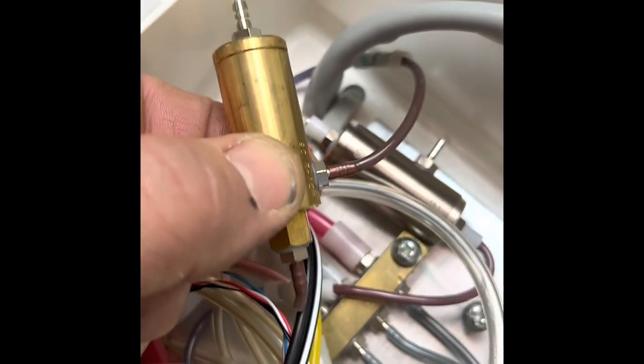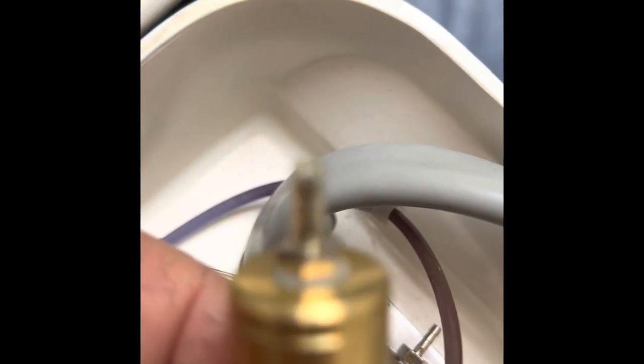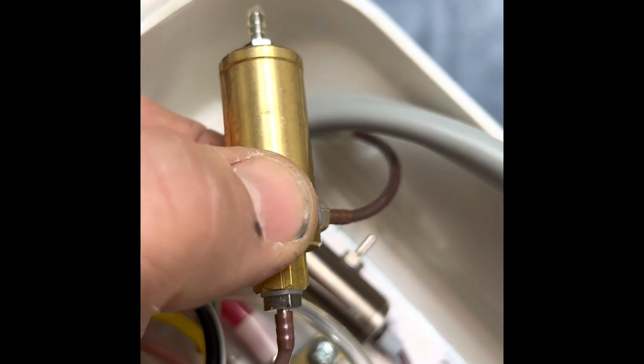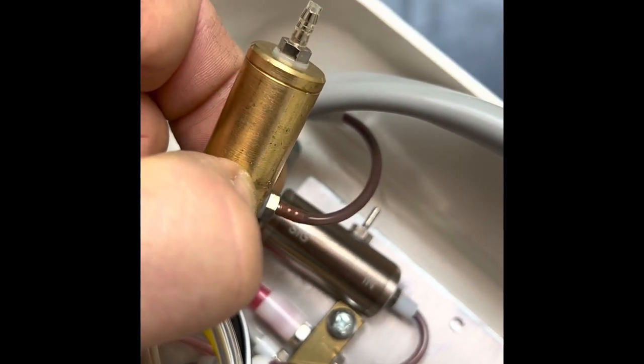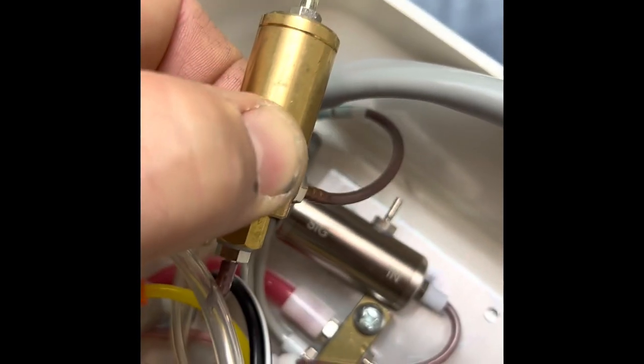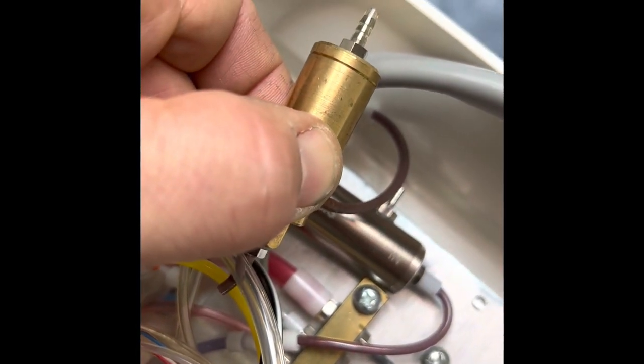Okay, I just found something really interesting. I just started replacing that and I'm hearing this little noise. Okay, so now I can actually hear it. So I think the diaphragm is actually backfeeding air through the water line and through this clipper valve. Super interesting. So I think I need to replace that diaphragm.